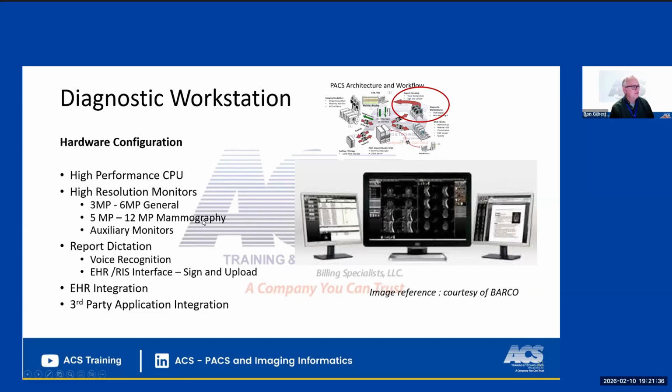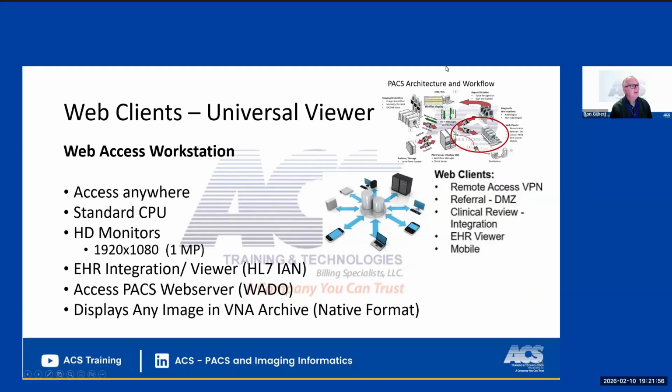And then you have high resolution monitors. You don't need the mammography monitors to do everything, but you'll need to know how many you need to do that. And then the auxiliary monitors. Report dictation, you're going to install that interface and radiologists will dictate on it. And then third-party applications, as I mentioned, the other systems. And then also the web client.